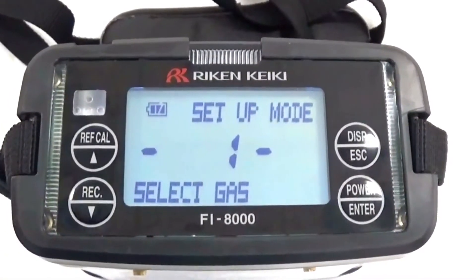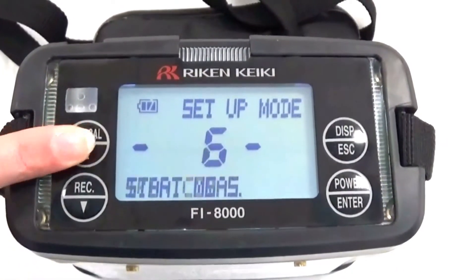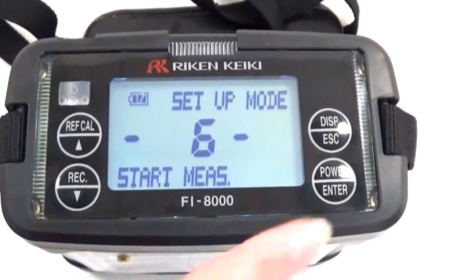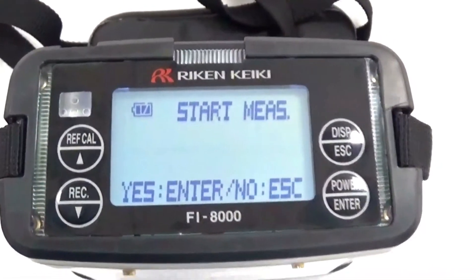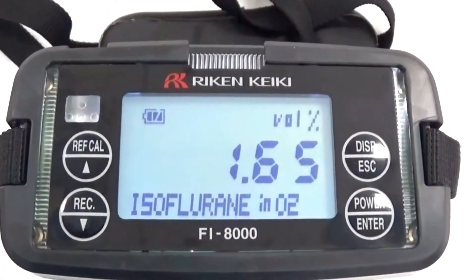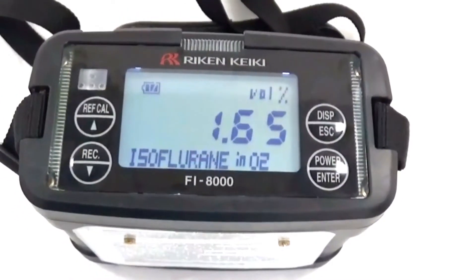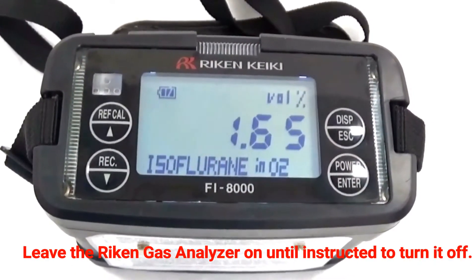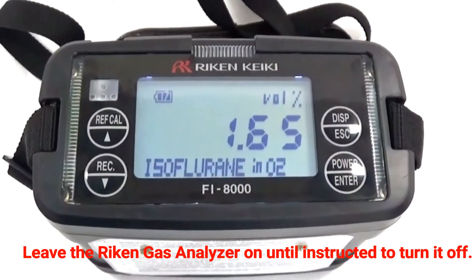We will arrow up to number six: start measure. We will now press enter. It says start measure — yes or no; yes is enter. We will hit enter again. Our air cal value is 1.65. Note that isoflurane in O2 is 1.65 on the air cal, and sevoflurane is 1.70.